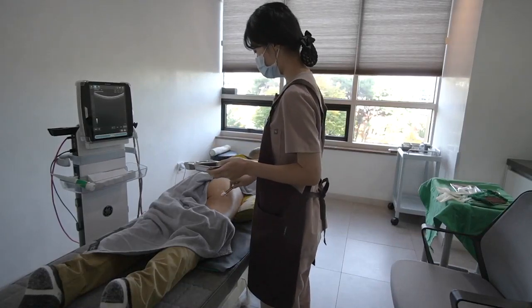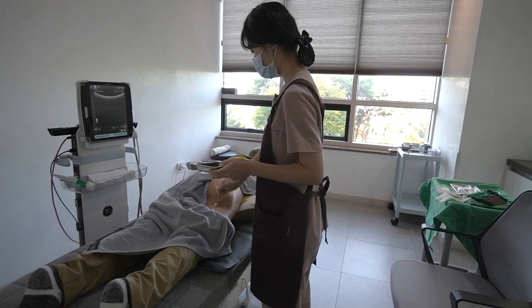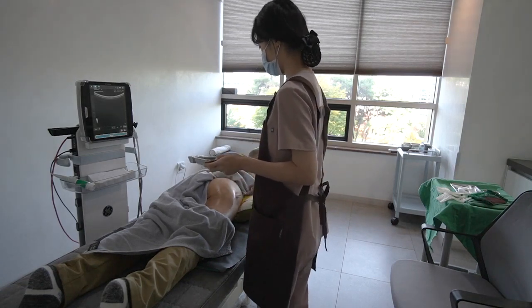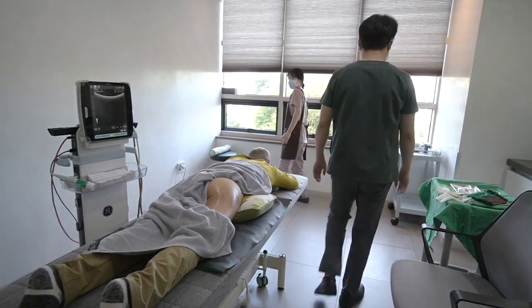Welcome back. I am Dr. Li's AI Speaking Assistant in Practical Pain Management. In the ultrasound room, I will show you some basic ultrasound practical anatomies and ultrasound guided interventional procedures.